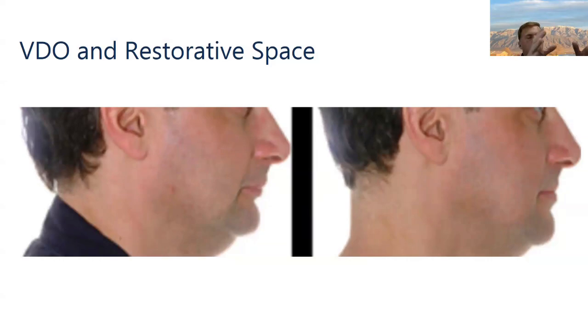As you get the tooth position and as you know the materials and as you've analyzed the patient, then you can decide, do I need alveoplasty? How much? How many implants do I need? Where should they be? We're kind of talking about each factor individually, but they're not siloed in real life. In real life, you put them all together to find that perfect treatment for your patient.